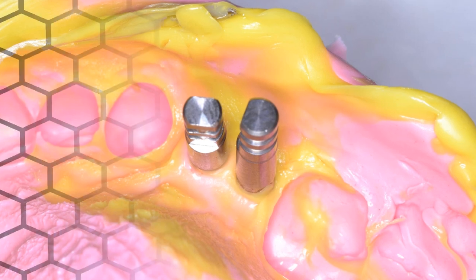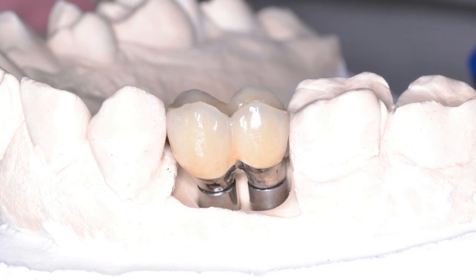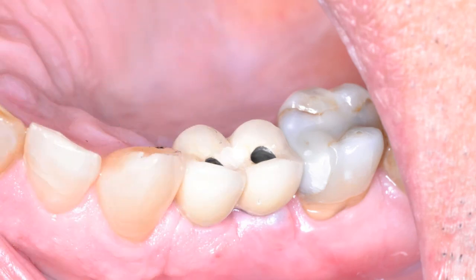And when we get this back, basically you evaluate it from the lab perspective. We had these two teeth fused just because we were putting onlay bone graft in this area. Any sort of grafted bone is never quite like natural bone, so I'm always a bit iffy. So as opposed to giving the guy two separate crowns, I said, you know what, let's splint these together and get the support from splinting in this particular case. Intraorally, you can see this is what it looks like. Beautiful, nice emergence profile. We restore those UCLA abutments' screw access holes with some composite resin and some Teflon, and it looks great.